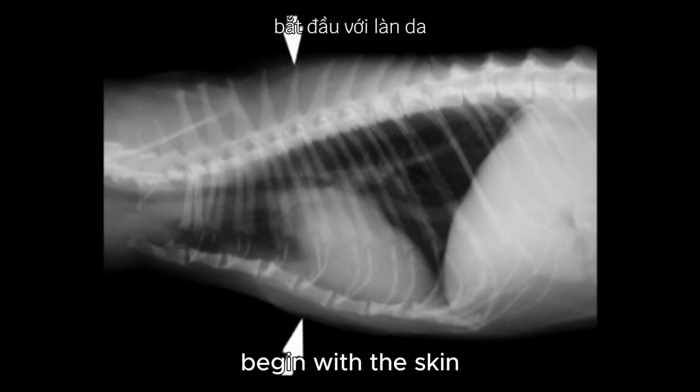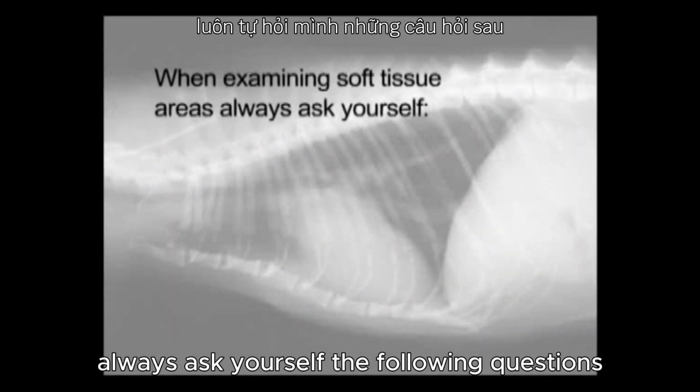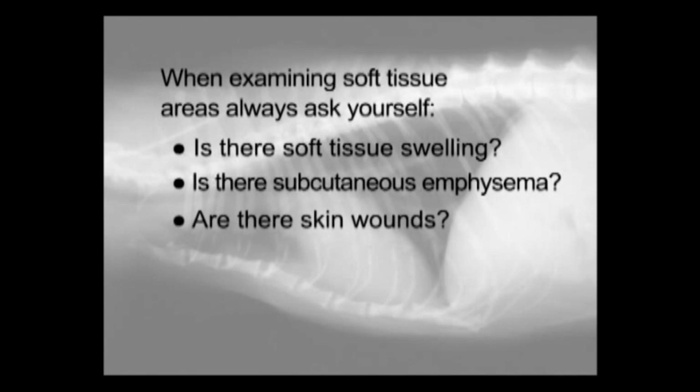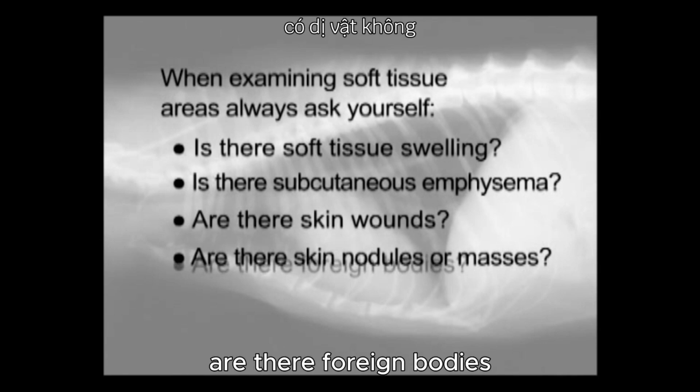Begin with the skin. When examining soft tissue areas, always ask yourself the following questions. Is there soft tissue swelling? Is there subcutaneous emphysema? Are there skin wounds? Are there skin nodules or masses? Are there foreign bodies?